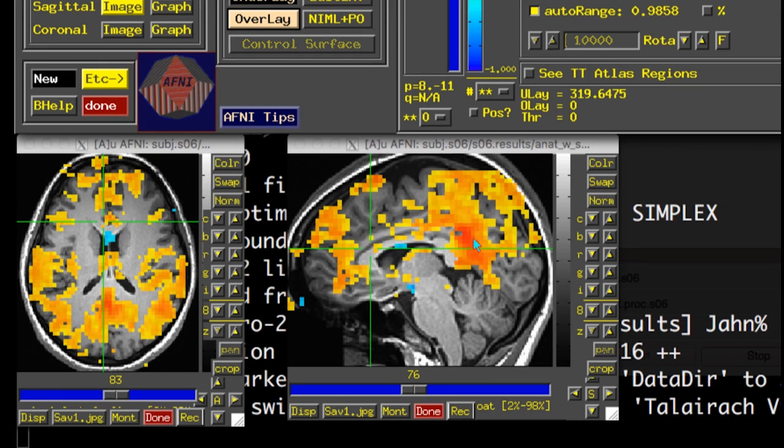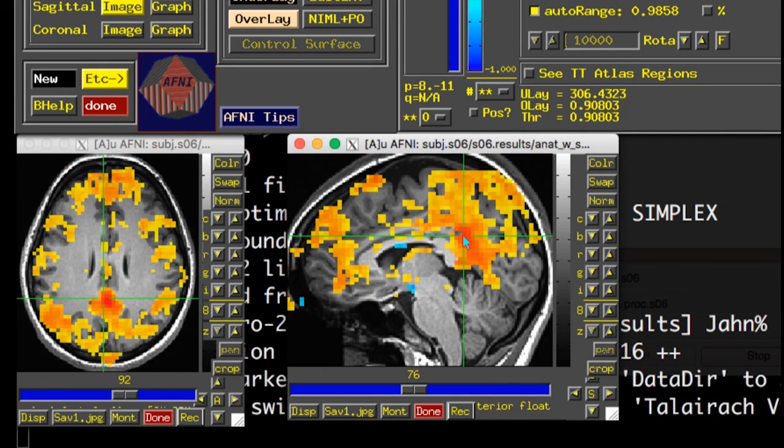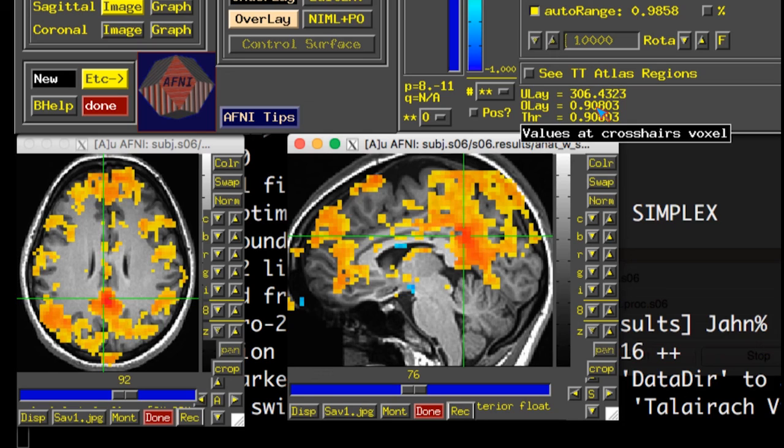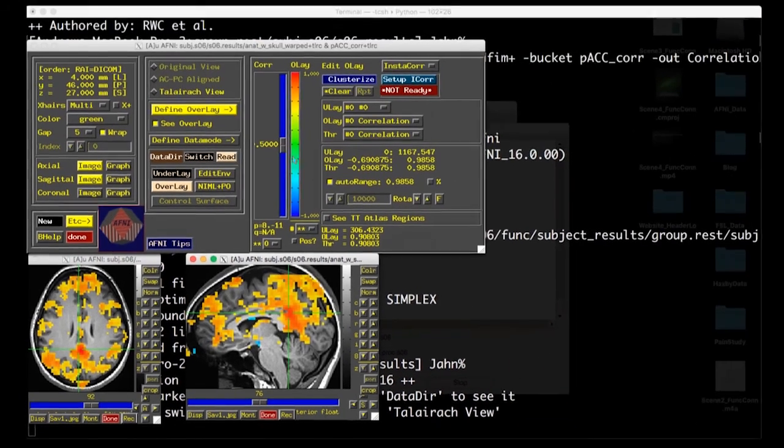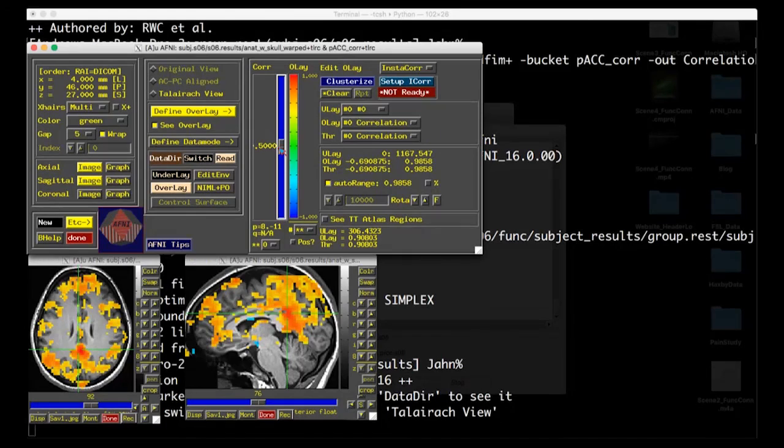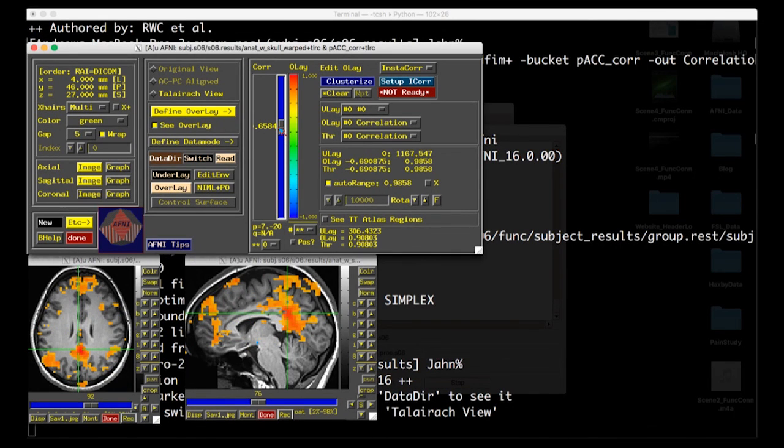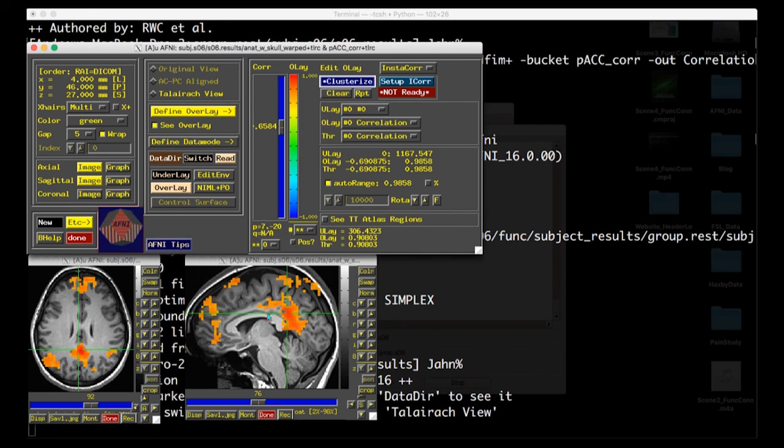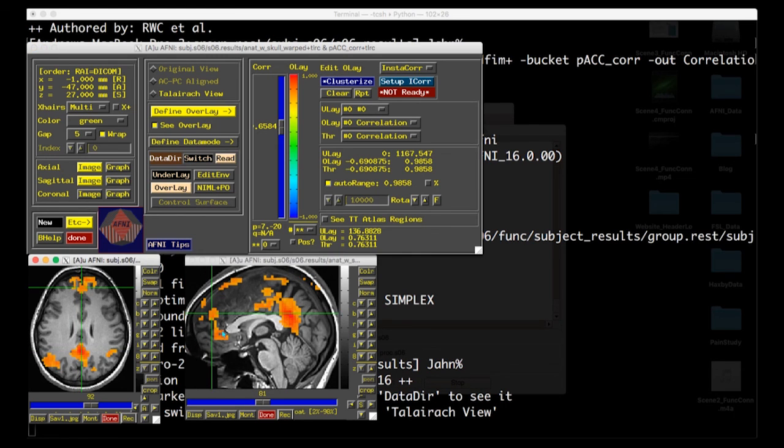And I'm going to overlay this on our anatomical image just to get a better sense of where these things line up anatomically. So overlay PCC correlation. This is the correlation map. And what you'll see is, obviously, there's going to be a high degree of correlation around that area where we placed the mask. And you can see the values right here. So correlation is about 0.9. Again, since we averaged over a relatively big sphere, a radius of 5, it included about 20 voxels. It's not going to be a correlation of 1 anywhere because we averaged across a bunch of things, right? But it's going to be still pretty high in that area. And notice that if I threshold this a little bit to clean it up, maybe clusterize, I'll see that, indeed, I do get pretty good correlation with the anterior medial prefrontal cortex. This looks like a pretty typical resting state network.